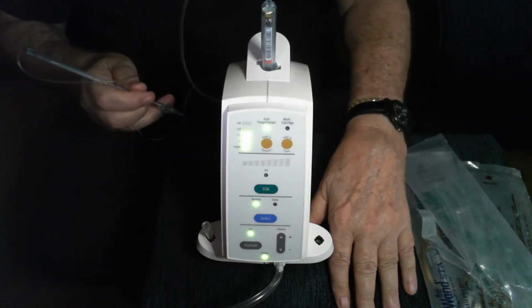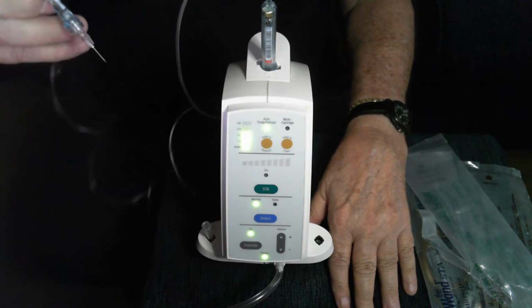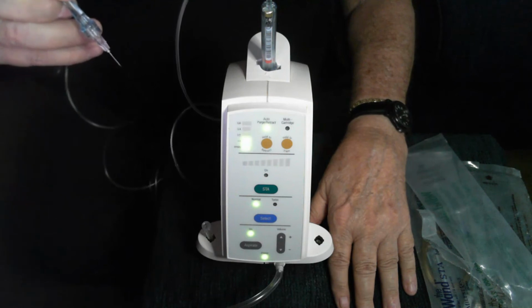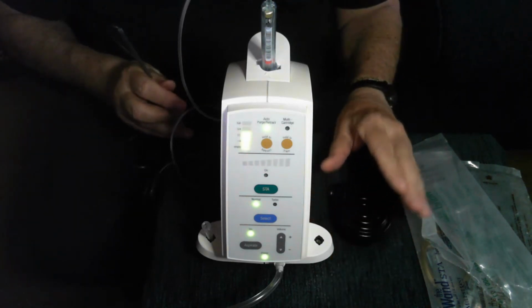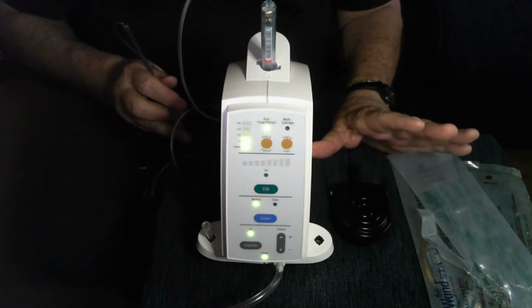You heard that gong? That told me that 1/4 of the cartridge was finished. So it's dispensing the cartridge at a very rapid flow rate. It would take about 50 seconds to deliver the full cartridge. You heard half the cartridge being finished. So when I take my foot off of the foot pedal, it goes into automatic aspiration.